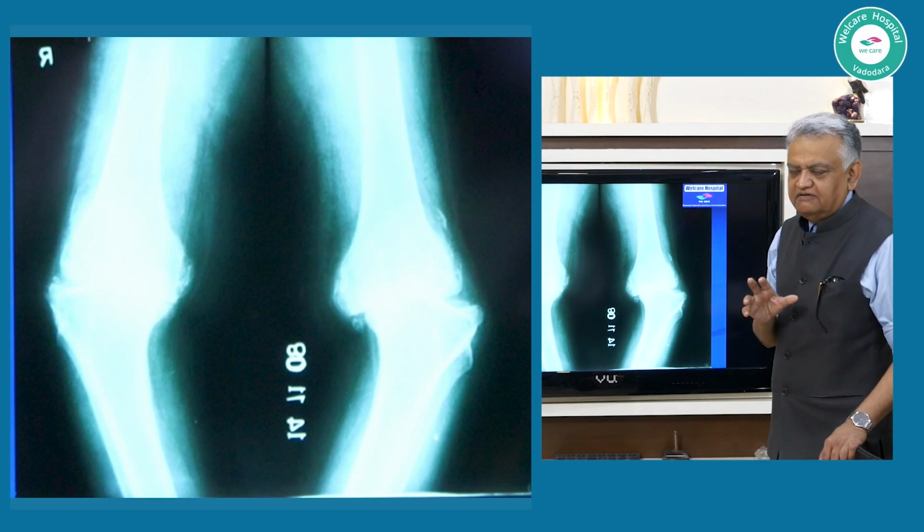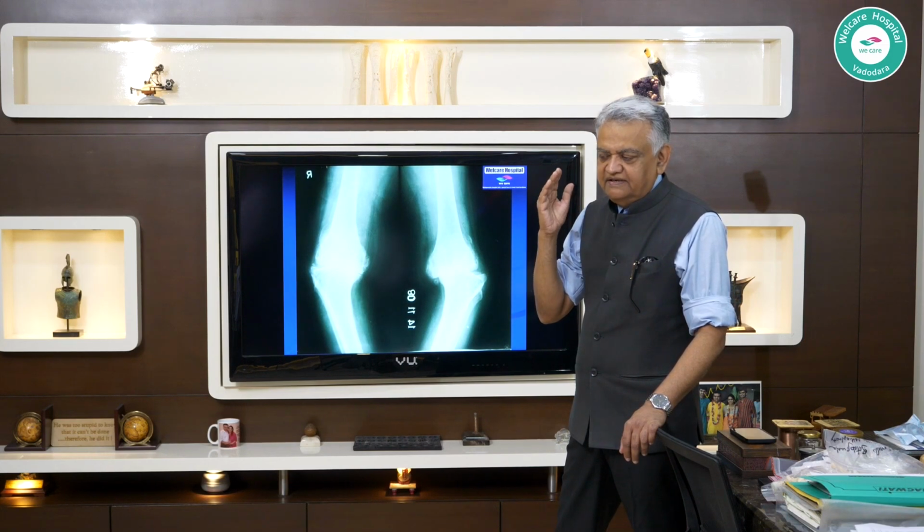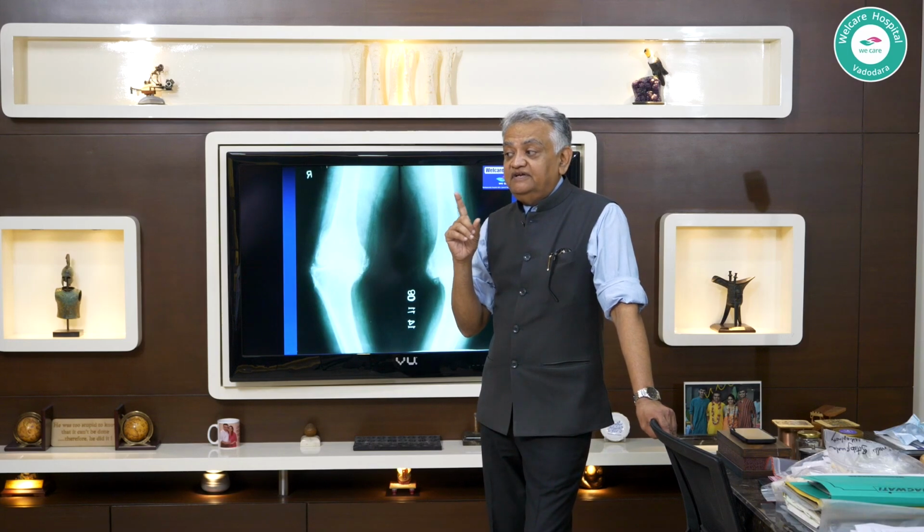And lastly, although it's unlikely, you might want to be mentally ready once in a while for a TC3 type of component. Typically you would be using either posterior cruciate sacrificing or cruciate retaining components. But let's say, despite everything, you find that there is too much laxity on the lateral side. Now what do you do?